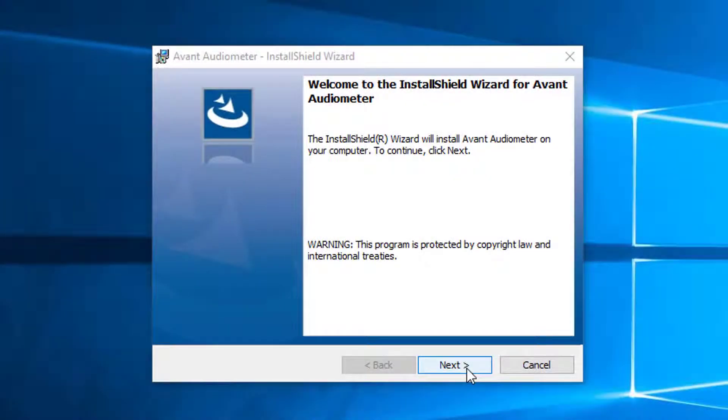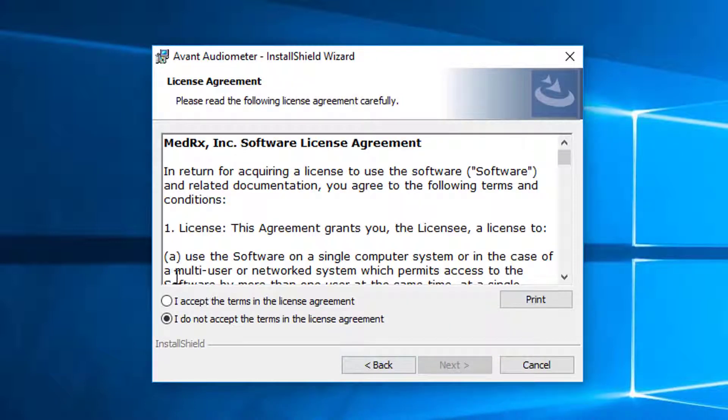This is the Welcome screen. To continue, click Next. After reading the software agreement, select I accept. Click Next.